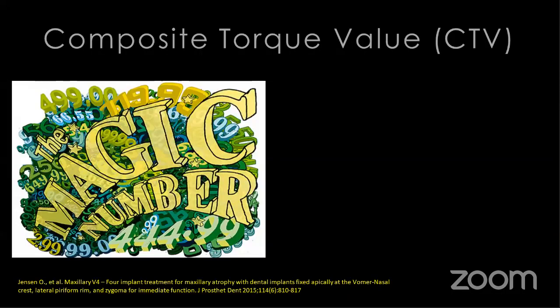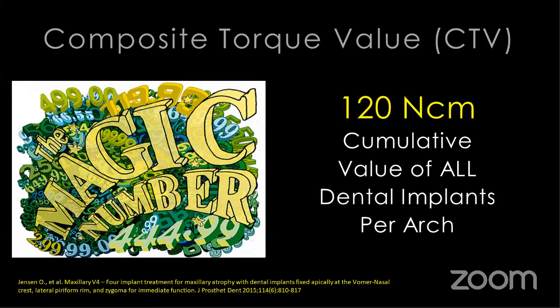So what is CTV? What's the magic number on this? Ole Jensen was the one that coined this term. And typically, in most of his articles, he's referencing 120 Newton centimeters of composite torque value. So if you're adding up all of your insertion torque for all of your implants, if you can come up with 120 Newton centimeters, then we know that you have a very good chance of having a successful outcome.